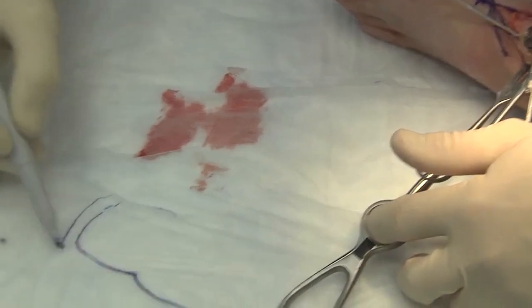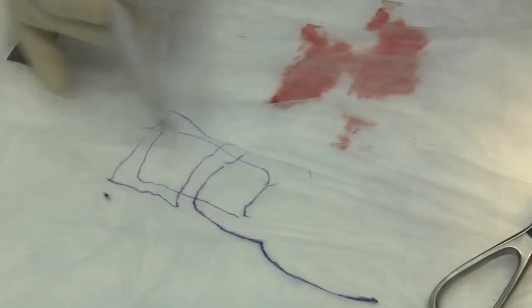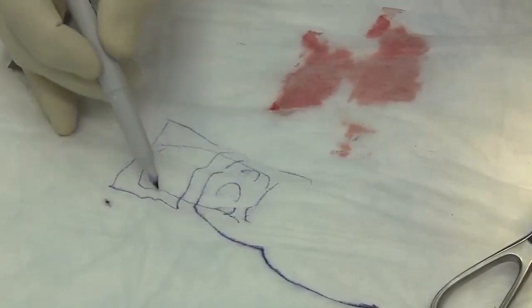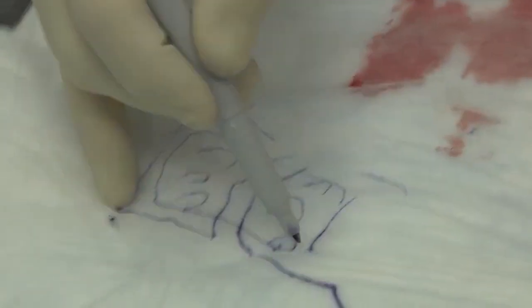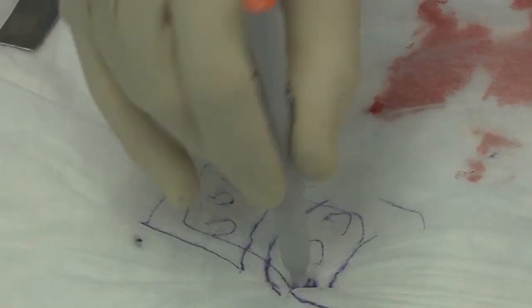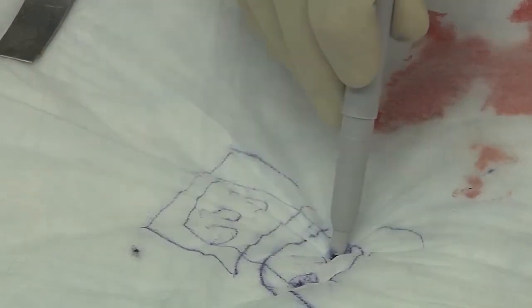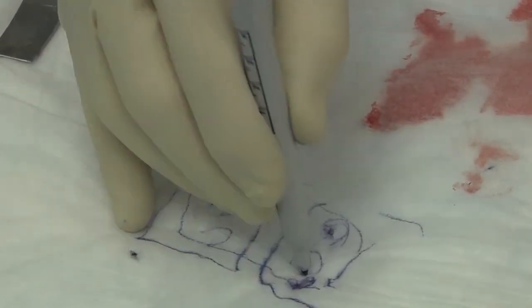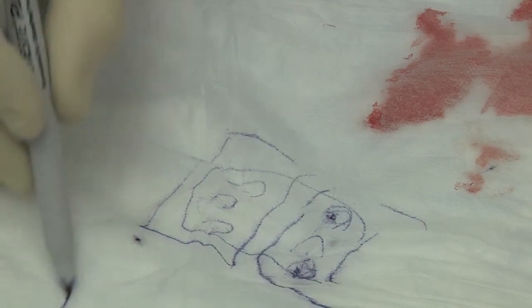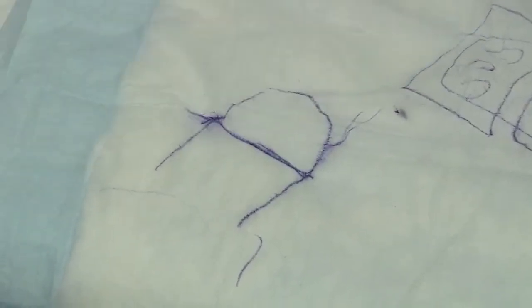Here's our talus and here's our navicular — we have our plate laying right here, with three screws available in each bone. This proximal screw is going to achieve maximal success if it's angled either straight across or slightly plantar; this screw should be angled slightly dorsal. They all have a variable 15-degree option or a fixed option. On the AP x-ray, the talar neck — our plate is coming over from the medial side — so we actually want to measure the length of these screws and engage that lateral cortex.